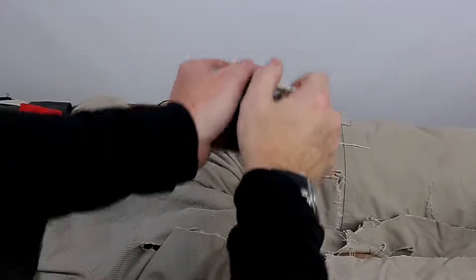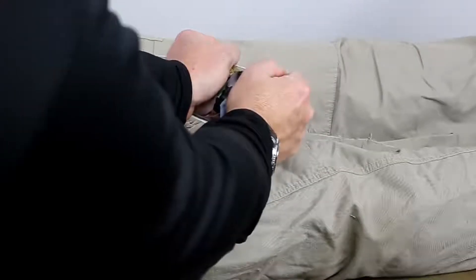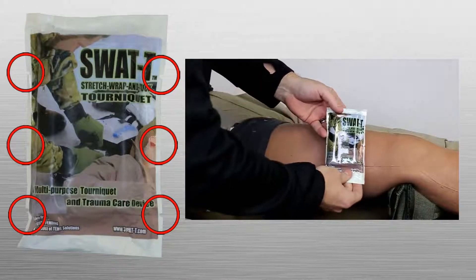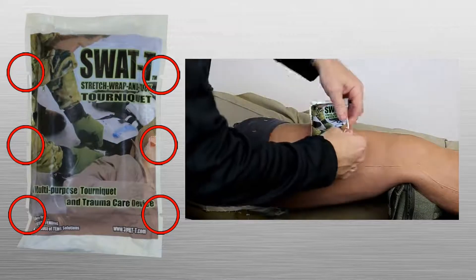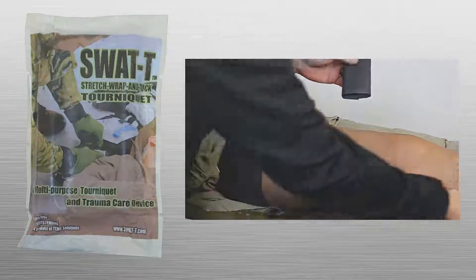Open the package. The twist snap method of opening has been found to be the simplest and fastest method of removing the SWAT-T from its packaging. Tightly grip the SWAT-T overhand with thumbs to the center and turn your hands forcefully in opposite directions. The SWAT-T packaging also has six tear points located on the sides, allowing for traditional horizontal opening at the top, bottom, or center of the package.